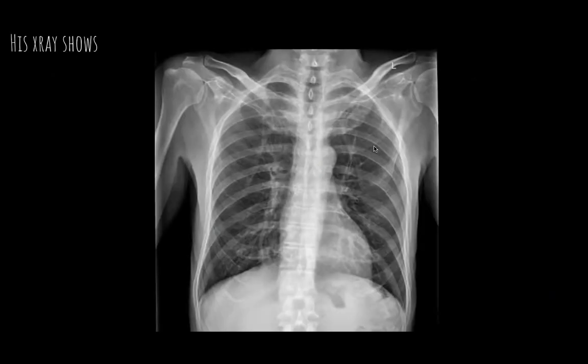All right, so this is his X-ray right over here. If you want, take a minute and take a crack at it and see what's going on. Other than that, we'll go through it together. Remember our ABCDEs. First thing is A, airway, which is the trachea right here. Looks midline to me, looking good. B, breathing. You see the lungs. I don't see a clearly defined pleural border. That's all good. The interstitial markings, which are this scattered stuff, also look good, roughly equal. The pulmonary vasculature also looks good, not too full or congested. So those all look good to me.